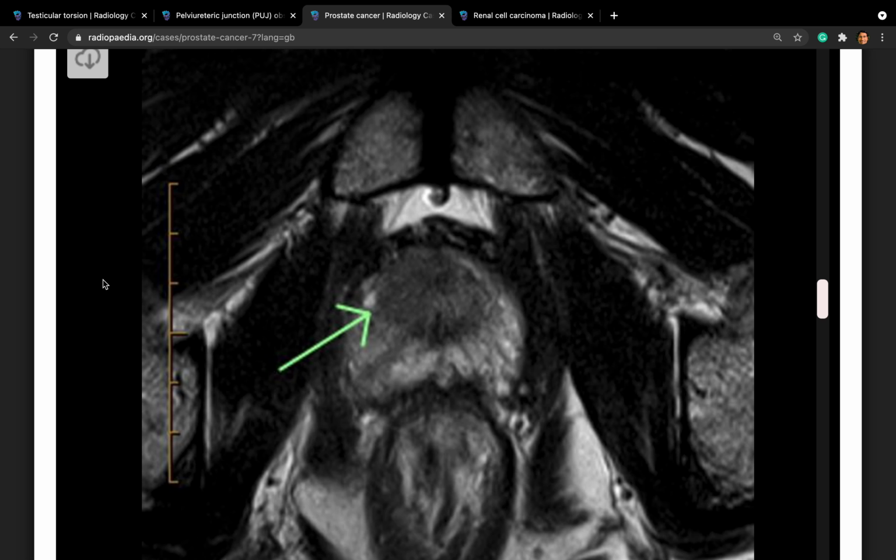removed, there is a phase 1, which is T1. There is a relaxation, which releases energy to the surroundings. There is a coil in an MRI scan which picks up that energy and transforms it into an image. Then there is a late phase, which is the T2 phase, which is a decay phase. And the amount of energy is being released to the surrounding tissue.